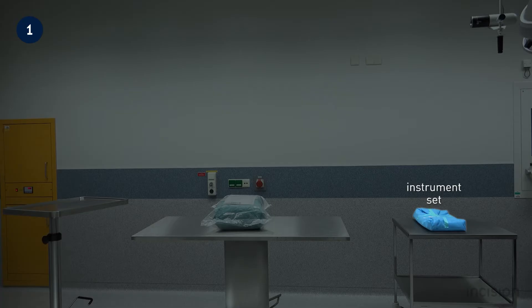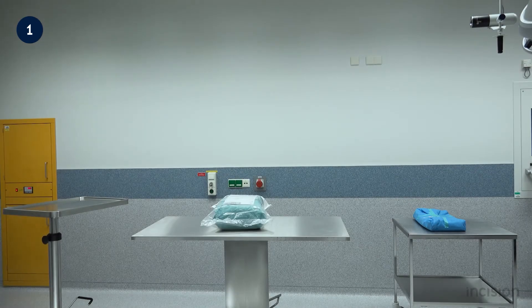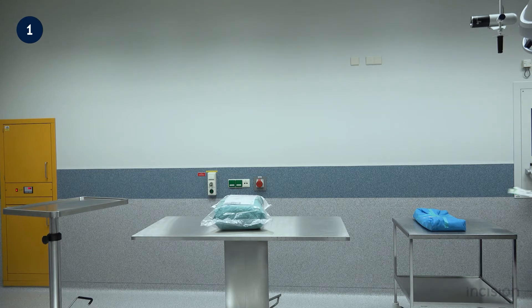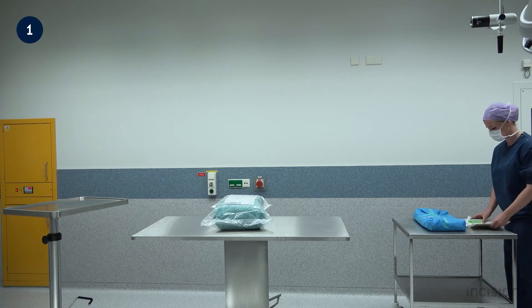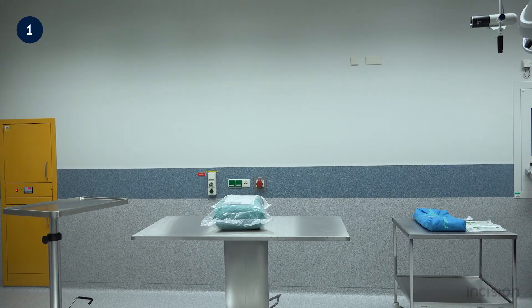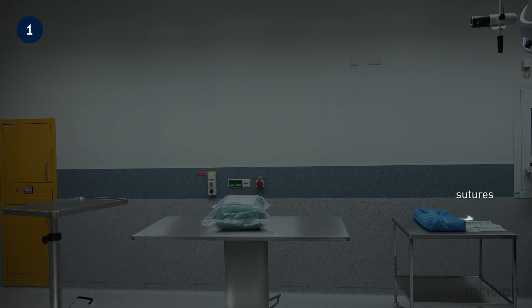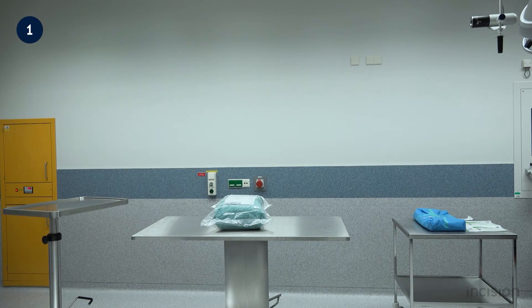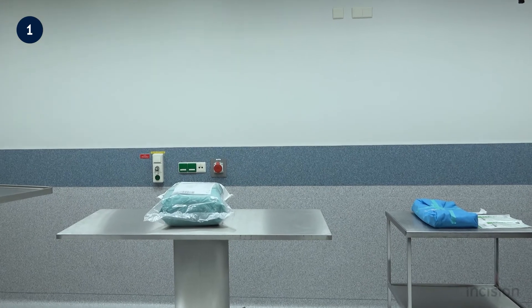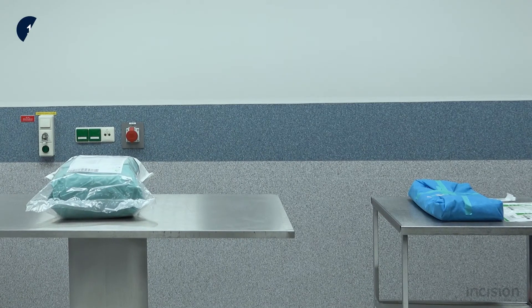Take note of the instrument set having been placed on the operating room trolley. Often, additional disposables not contained in the procedure pack are required. These should also be prepared prior to starting table setting. In this case, gloves as well as sutures are placed on the OR trolley ready for use. This is but one of many options for handling additional disposables. In some instances, the circulating nurse may be solely responsible for handling additional disposables.